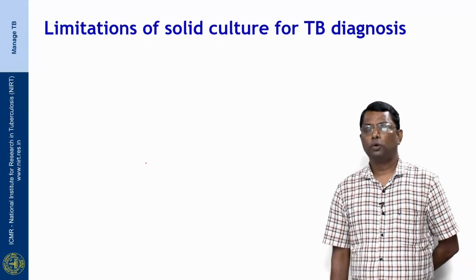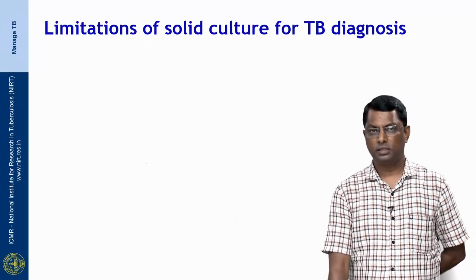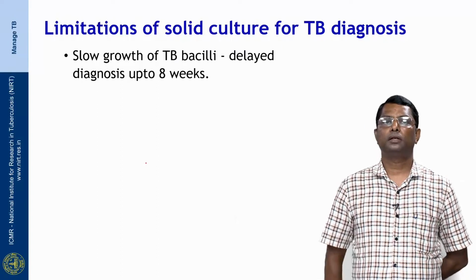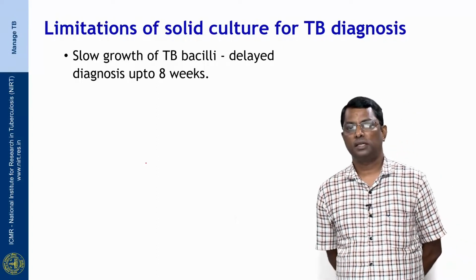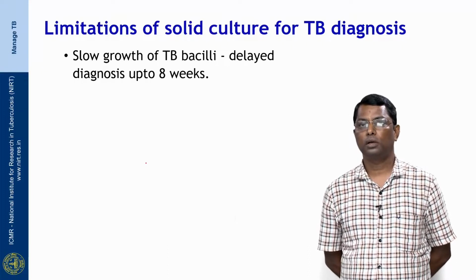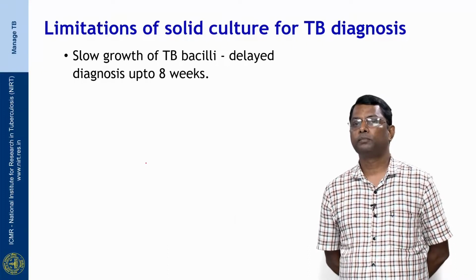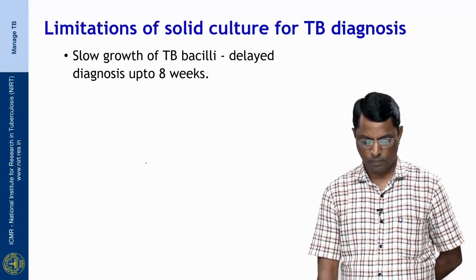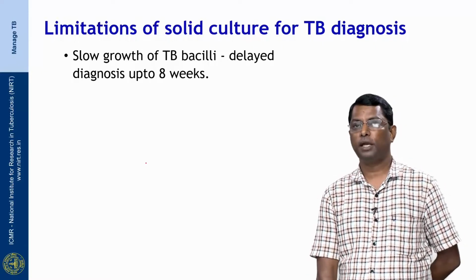Now, although it is the gold standard, this also has some limitations, as the TB bacilli grow very slowly in solid culture, and this can take up to 8 weeks. So, the diagnosis is delayed by 8 weeks.